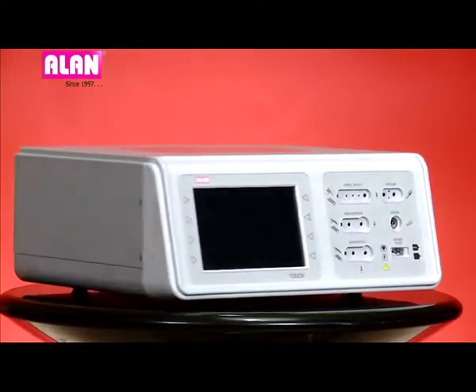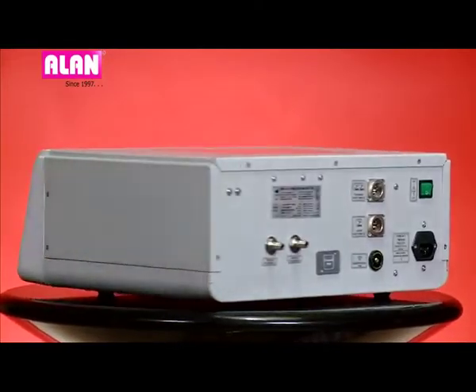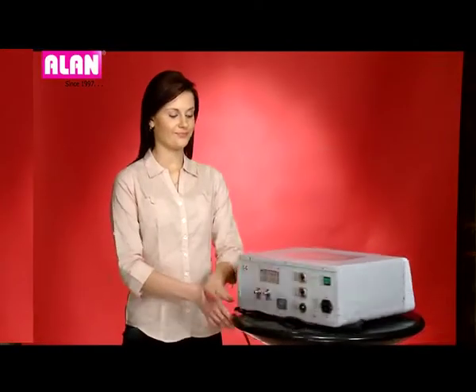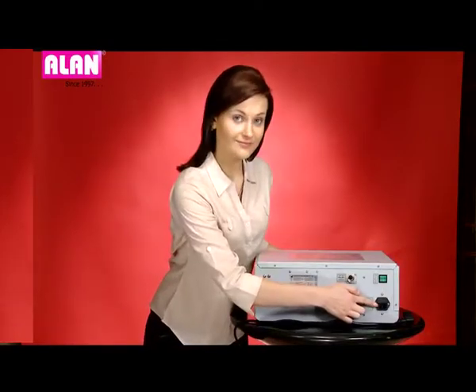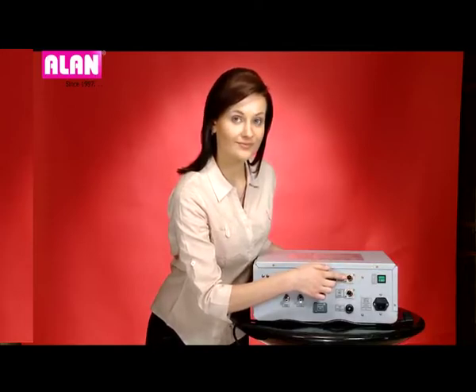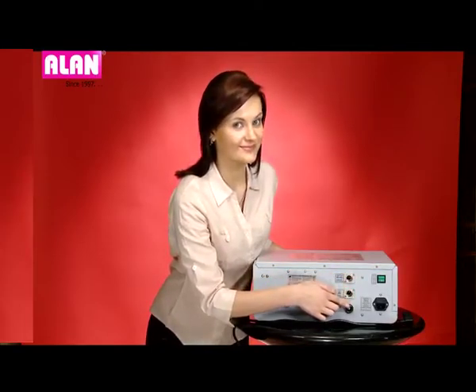This is a multifunctional electrosurgical unit with built-in APC. Let us see the connections of the unit. On the rear side we have IEC power inlet, power on-off switch, 2-pedal, 3-pedal standard foot switch connector, Ligate foot switch connector and equipotential pin.